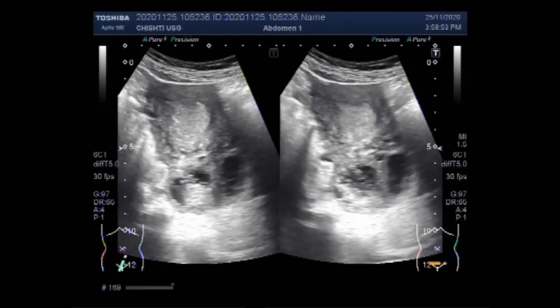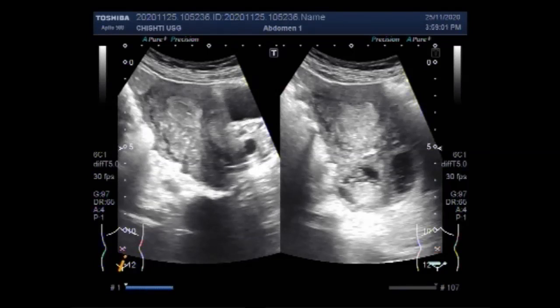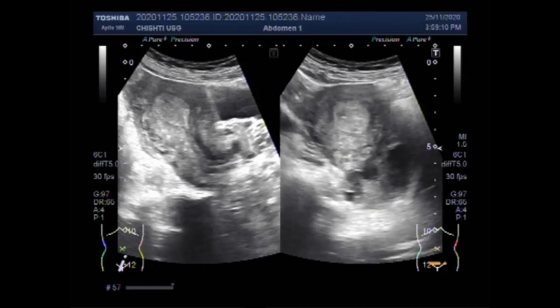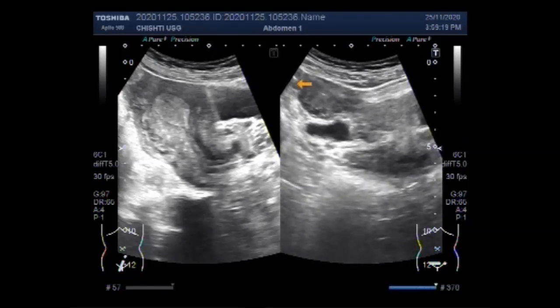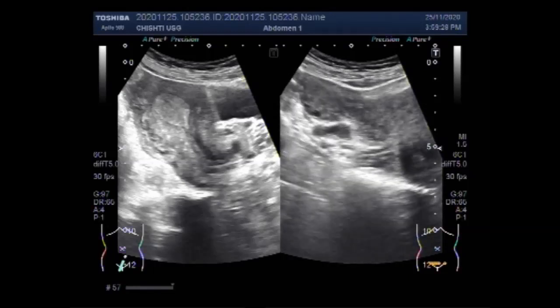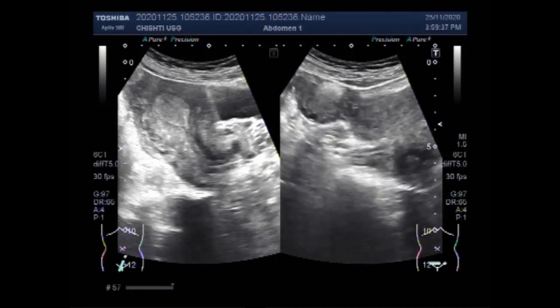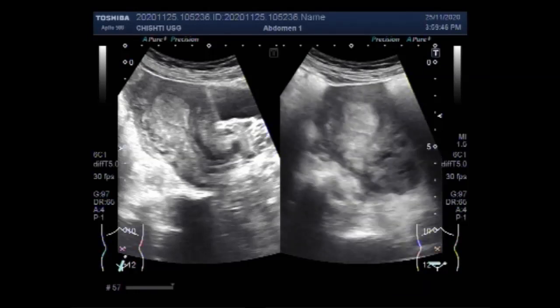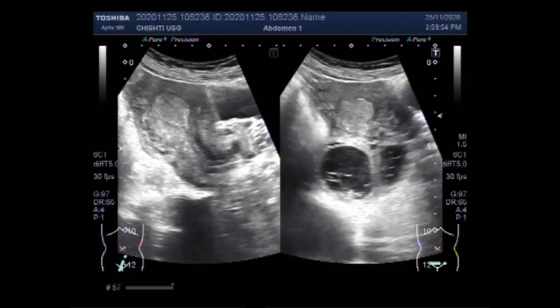Uterine polyps are more likely to develop in women who are between 40 and 50 years old than in younger women. Uterine polyps can occur after menopause but rarely occur in women under 20 years old. Now you can see the left ovary, and this left ovary is echo normal. The prevalence of endometrial polyps increases with age and ranges from 7.8 to 34.9%. Endometrial polyps are frequently seen in patients receiving tamoxifen. Other risk factors include foreign bodies, multiparity, chronic cervicitis, and estrogen secretions.